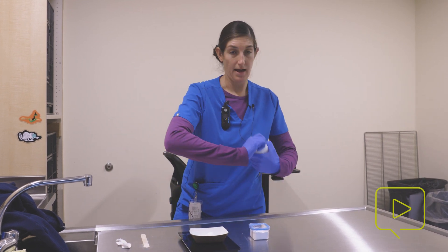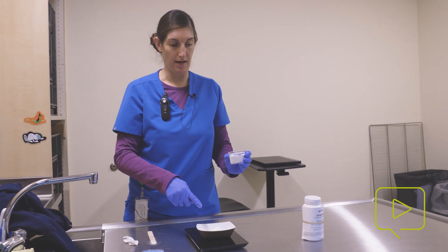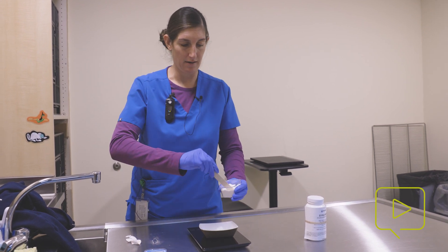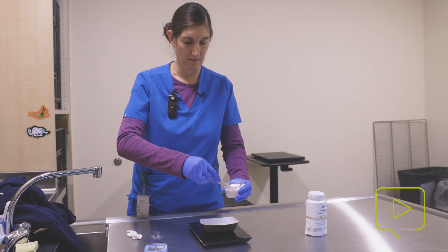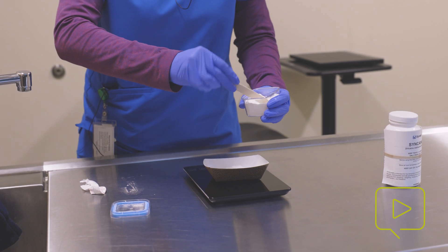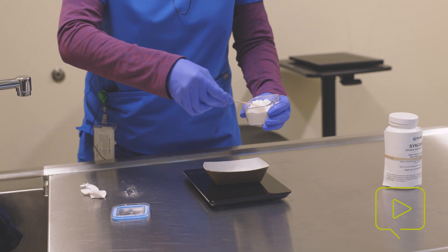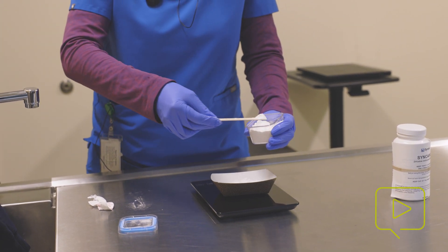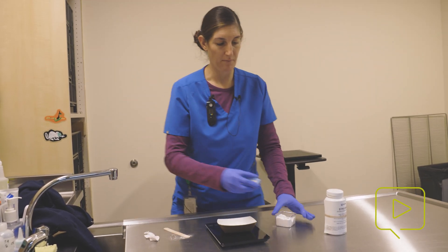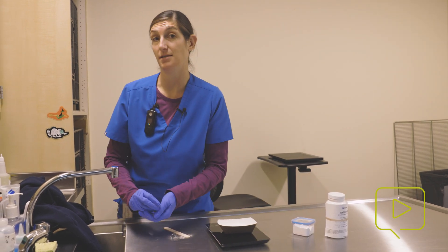I like to double-buffer the tricaine. So since I have 10 grams of the anesthetic, I'm going to use 20 grams of sodium bicarbonate — we'll just add this in here. All right, so now I have 20 grams of baking soda to 10 grams of my tricaine, and then we'll go ahead and mix up the stock anesthesia solution.